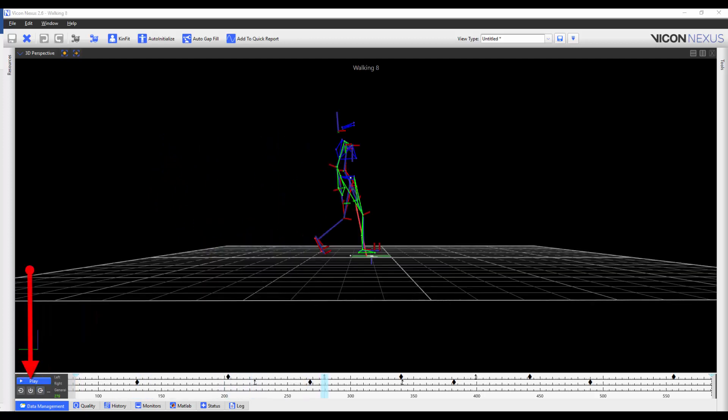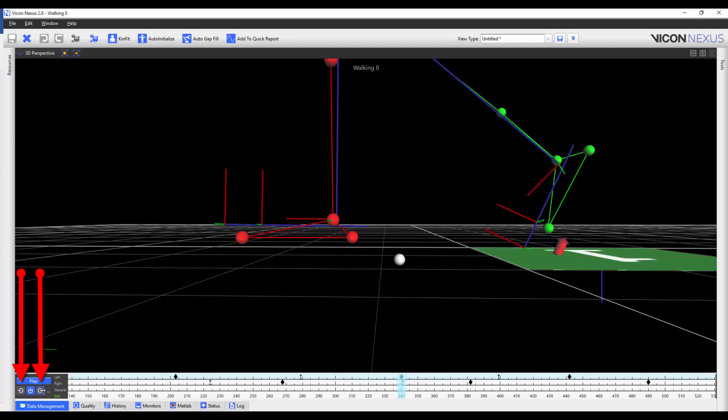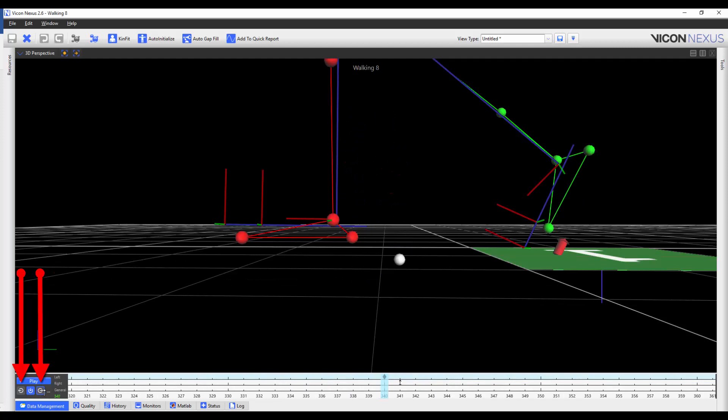When you are in the event identification mode, and when you press the forwards and backwards buttons, Nexus will jump to the next or previous event and it will zoom in on the appropriate marker and event. And the time bar will zoom to plus or minus 20 frames either side of the event.